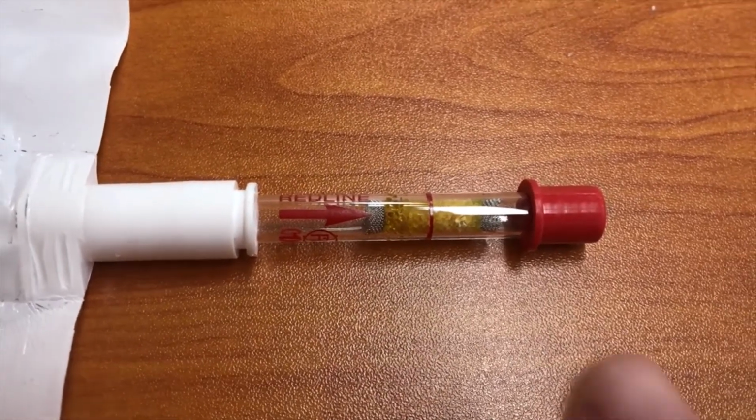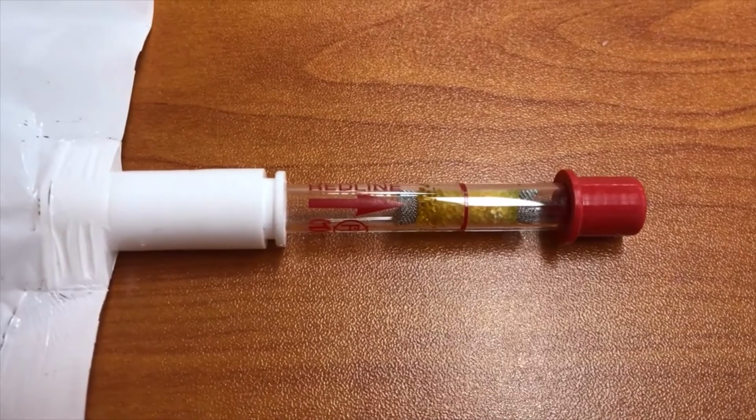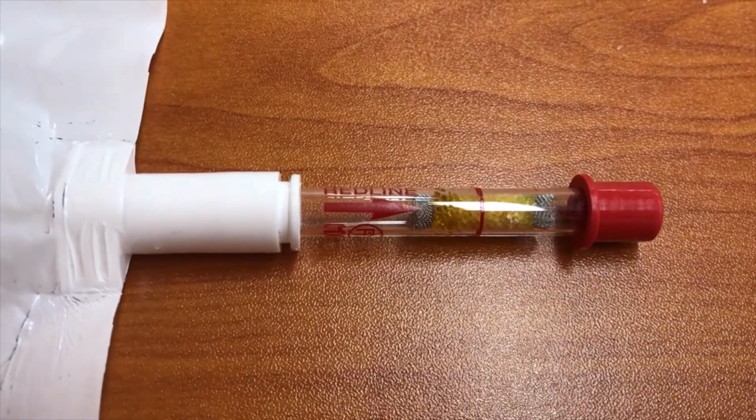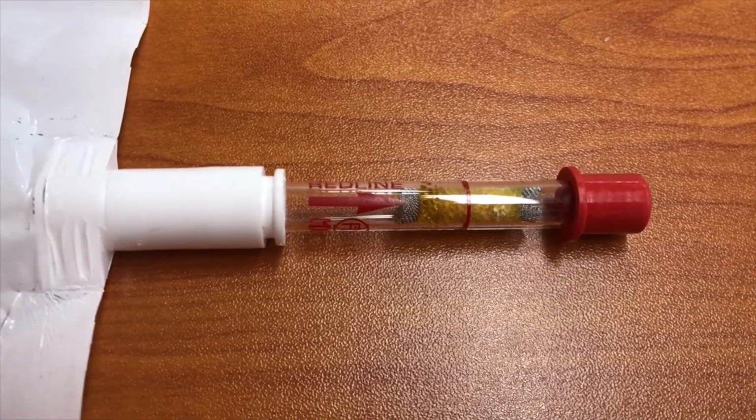Now if all the crystals were green, including those above the red line, that would indicate that the donor has a minimum of 0.05% blood alcohol content level.